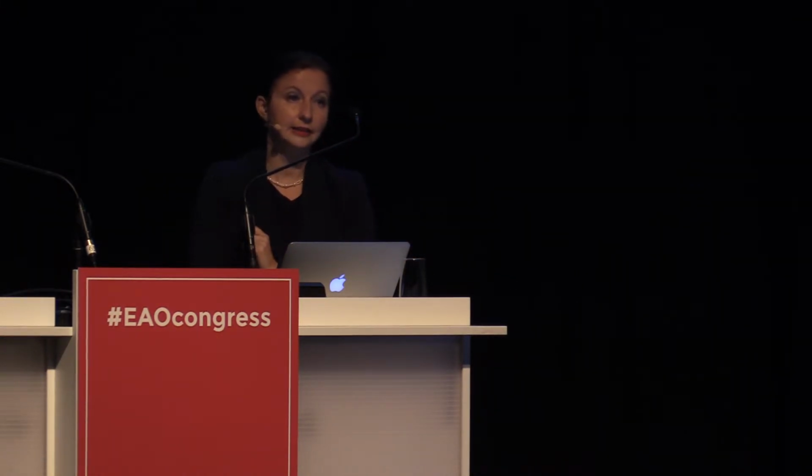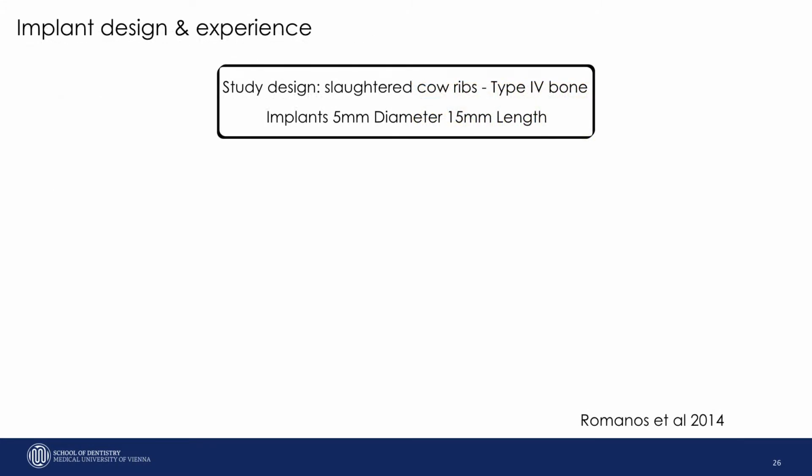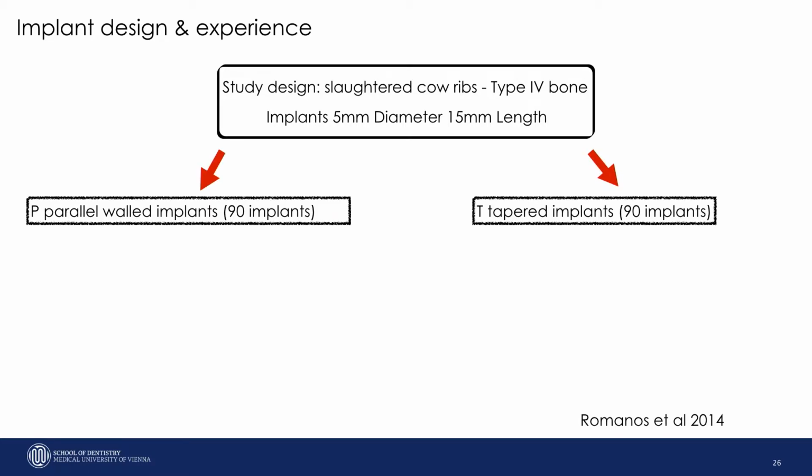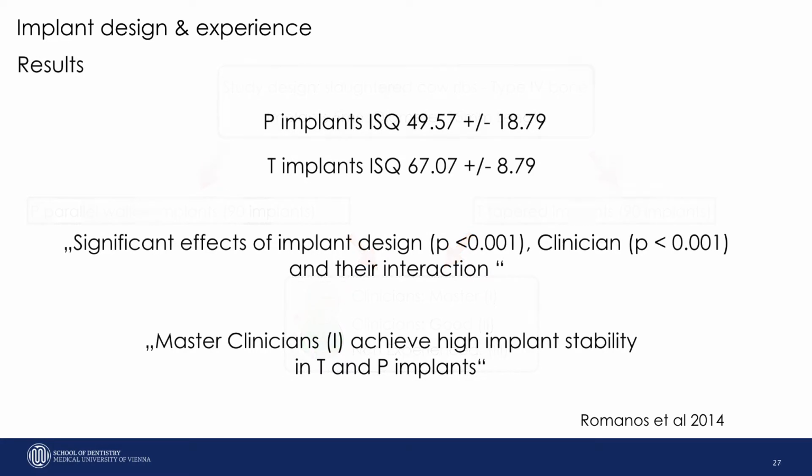Well, last but not least from this group, the implant design. When we go to implant design, there was a lot of development in the last years on the market. And again, I want to highlight the study by Romanos, where he did the study with parallel walled implants and tapered implants, and it's a study with the clinician master, good and non-experienced. And when you look at the result, you see that parallel walled implants had lower implant stability than tapered implants overall.